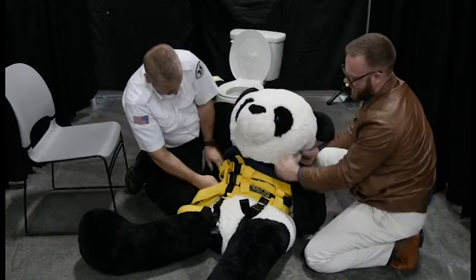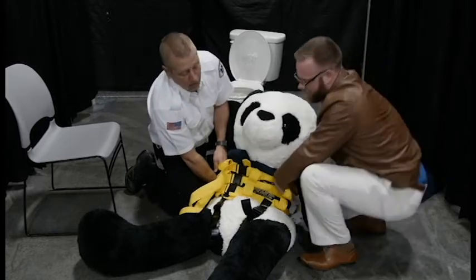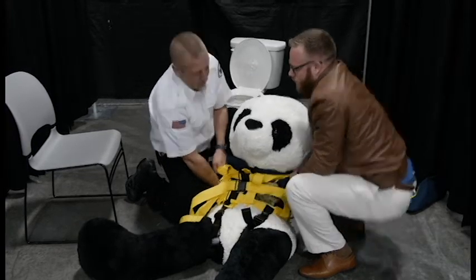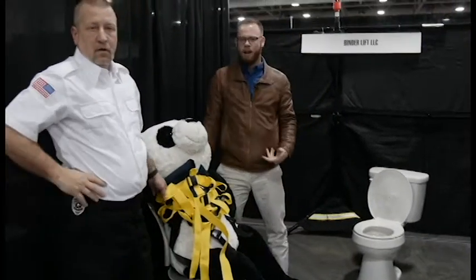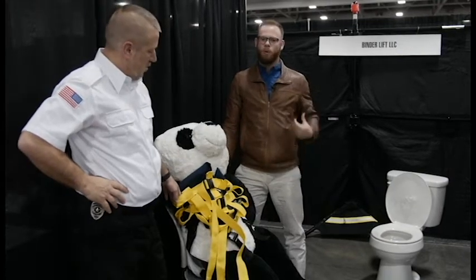Once the straps are tight, anything that is yellow is weight-rated to grab, so you can grab the handle that's most comfortable. On my count we're going to lift them up and put them in a chair. One, two, three. And now we have our patient in your stair chair, on your stretcher, or back in their Lazy Boy — without hurting the patient or hurting our backs.